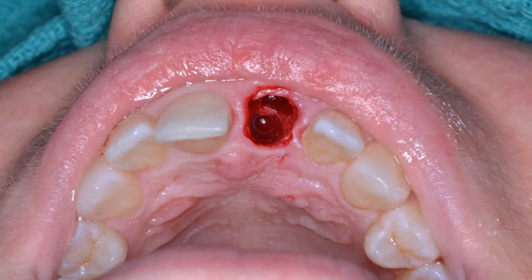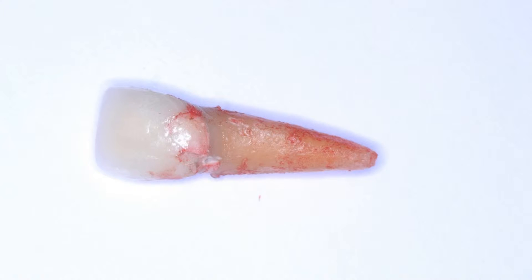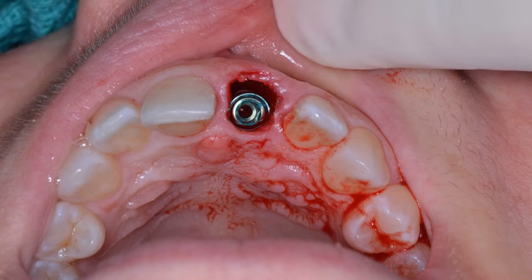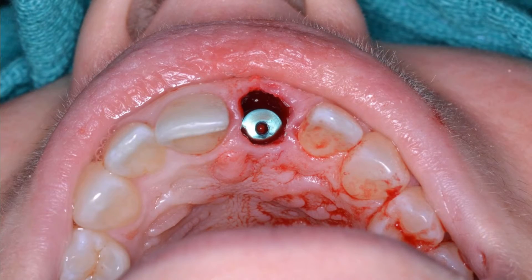We tried to basically maintain a screw-retained position for this particular restoration. In this picture one can see the nice application of the beak of the forcep towards this particular tooth — that's why I like the 76S. In this picture one can appreciate that failed post-core crown complex in the tooth. Here we have a picture of the actual dental implant placed. One can appreciate that there's a large gap jump junction on that buccal aspect. In this particular case I chose to graft the patient, so the cover screw has been placed.